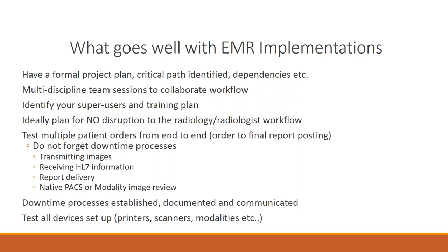Test multiple patient orders from end to end. Don't just do 20 chest x-rays. Make sure you have multiple orders. You have combination orders. You have orders that are unique. Look for ones for laterality. Make sure that all of these things come across properly.